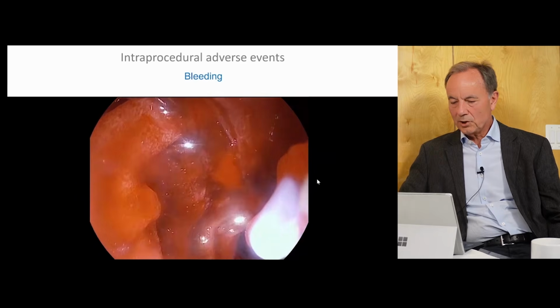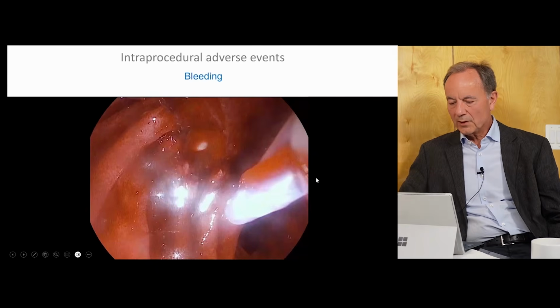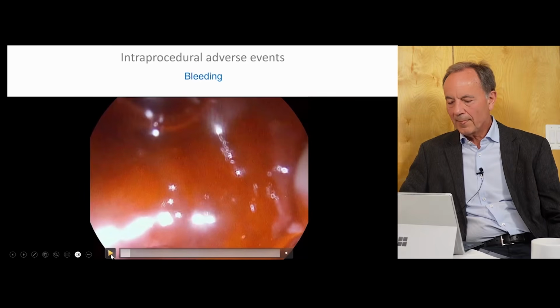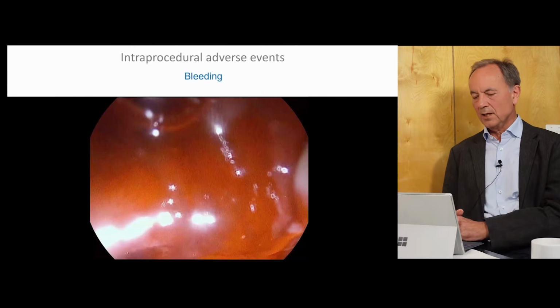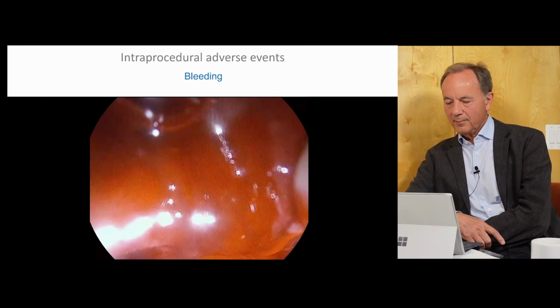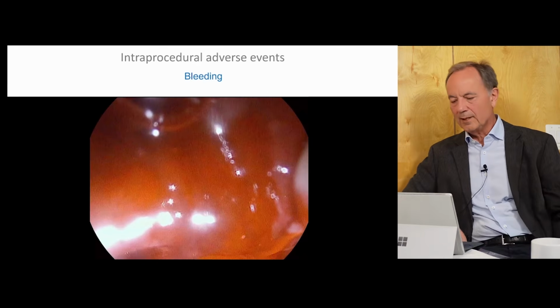but now I show a bleeding. So also a successful papillectomy, and I harvested the specimen en bloc. Histology finally showed also R0 resection, but I just removed the specimen and reinserted the endoscope and saw this kind of bleeding here. So the question is what to do.